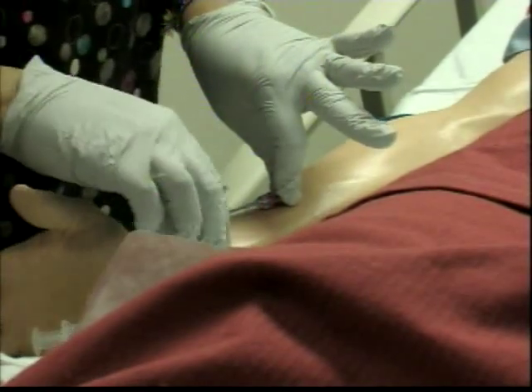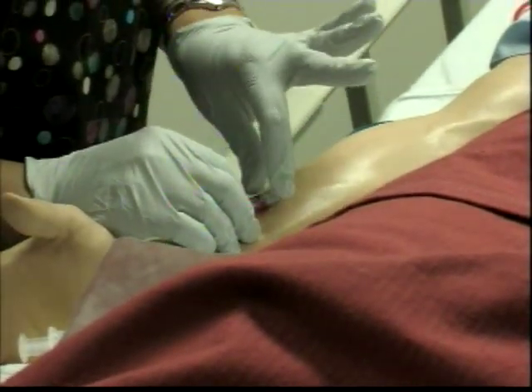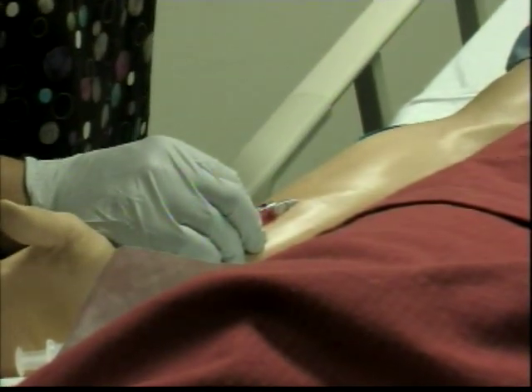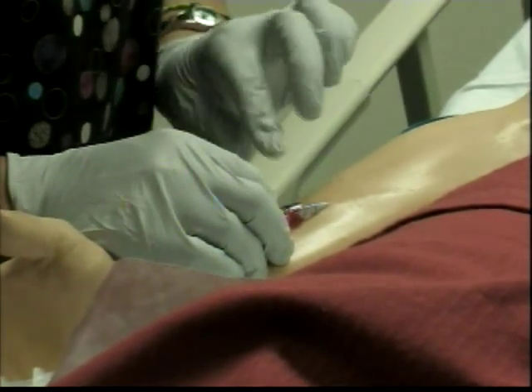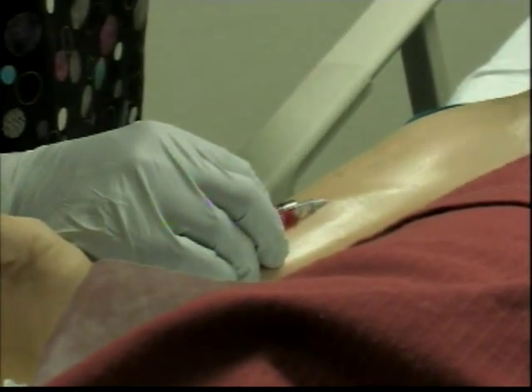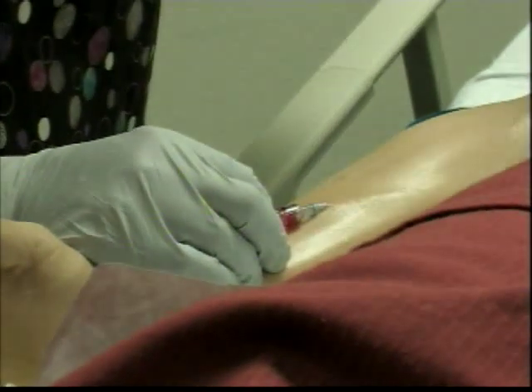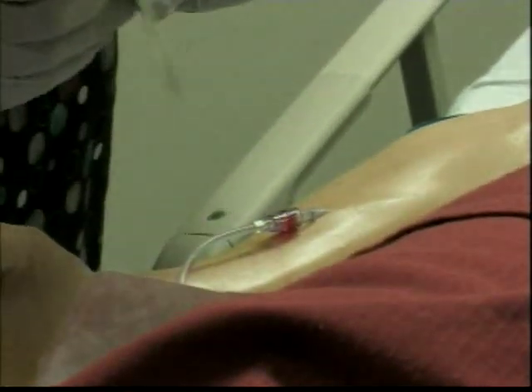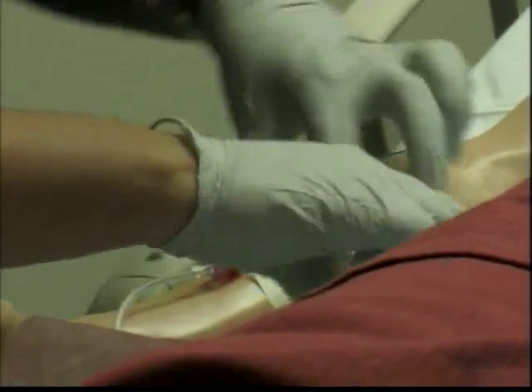And then I'm going to tell my client, will you please remain still for me, because now I'm going to tape it. I let go of that, but I'm holding it at the same time just to give the patient enough time to register that and say, yes, I'm holding still. If it's a client that is confused, you want to tell your partner, I'm going to remove this, please keep him still. And then you're going to remove it, get your tegaderm, and cover the hub of the catheter with the tegaderm.